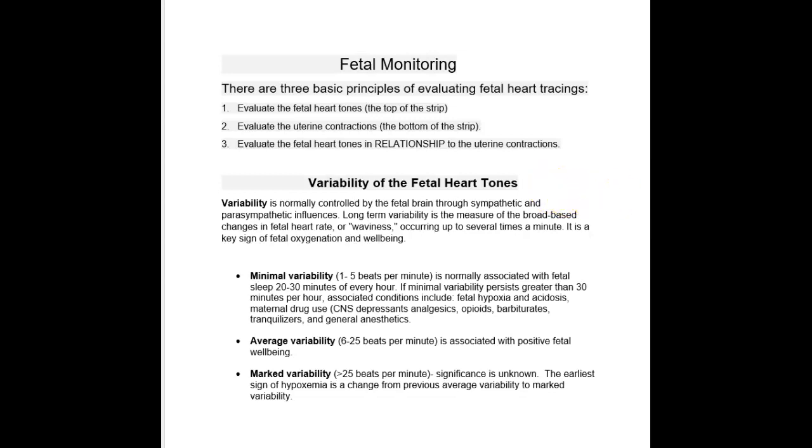Hi, you guys. I want to talk to you about fetal monitoring. When we go to the hospital, we're constantly monitoring the baby the whole labor, because we know when the uterus contracts, at the peak of the contraction, there's no oxygenation to the baby. So we have to be very mindful of the fetal heart rate to make sure that everything is okay.